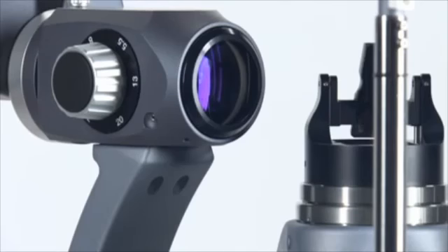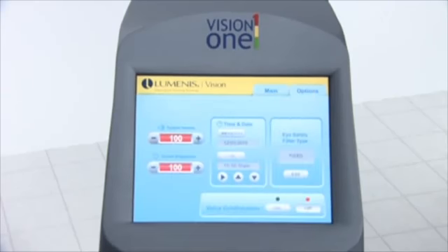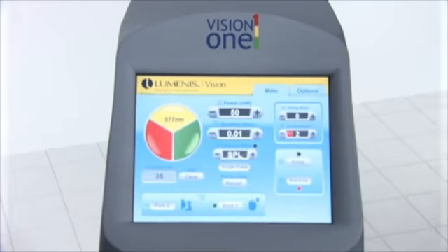If the electronic system detects a fault condition, the laser exposure cannot occur. The laser power supply is turned off, the safety shutter is closed, and the foot switch is disabled. Some fault conditions may be cleared by the operator. Refer to the troubleshooting guide in your operator's manual for additional information.